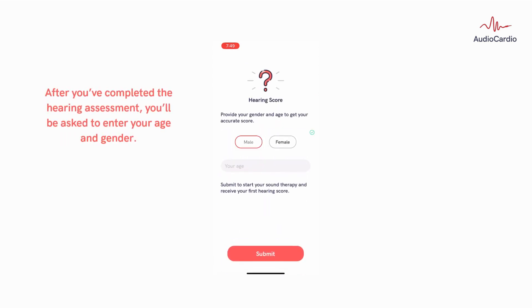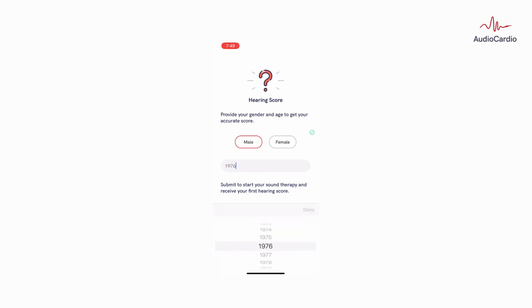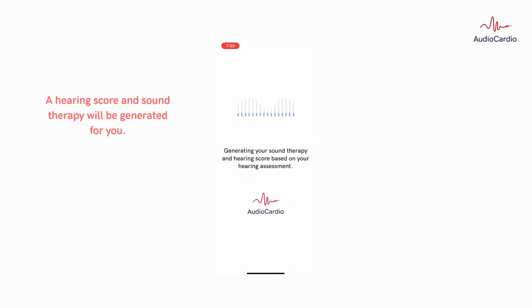After you've completed the hearing assessment, you'll be asked to enter your age and gender. A hearing score and sound therapy will be generated for you.